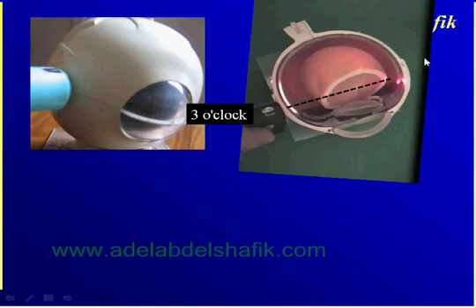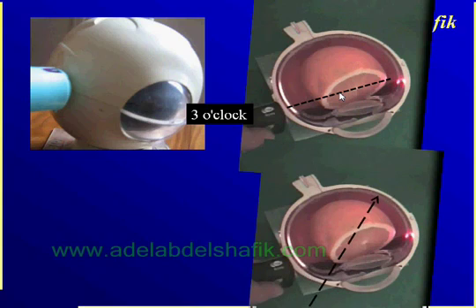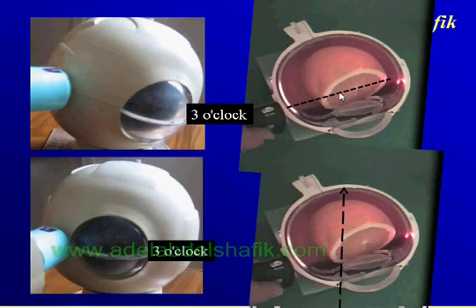I'm making a transverse section like this orange. I'm cutting it transversely. Transverse examination, actually, is not all the time a dead transverse. Sometimes in the first location here, it's a real transverse. But sometimes you go a little bit backward toward the equator, or even back to the optic nerve. This is not a dead transverse, but we are accustomed to speak about it.